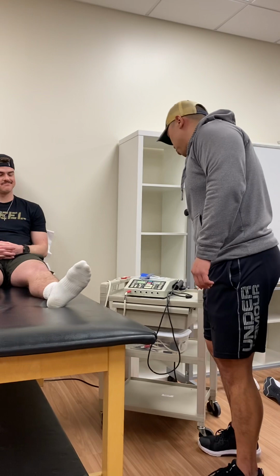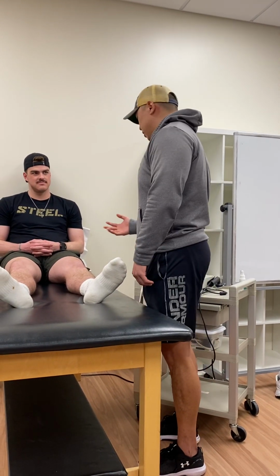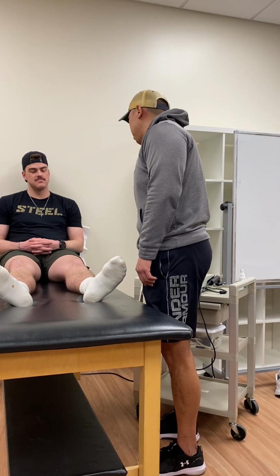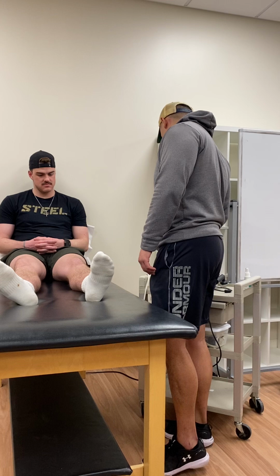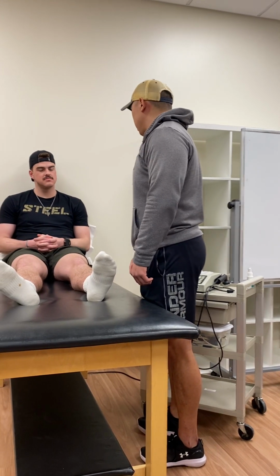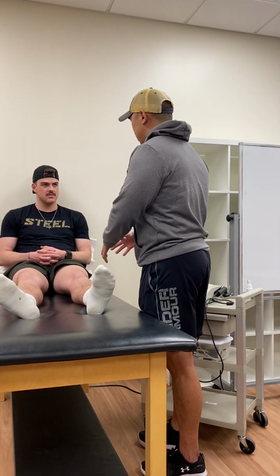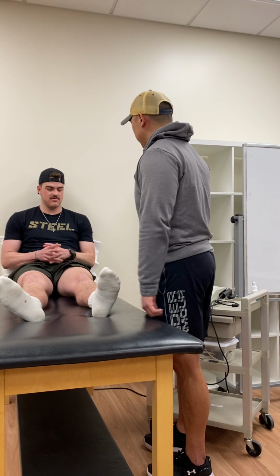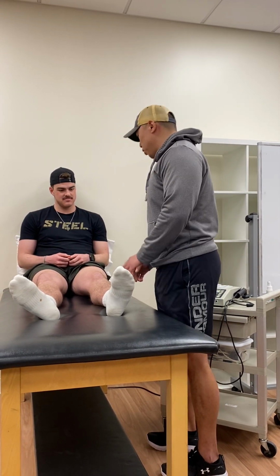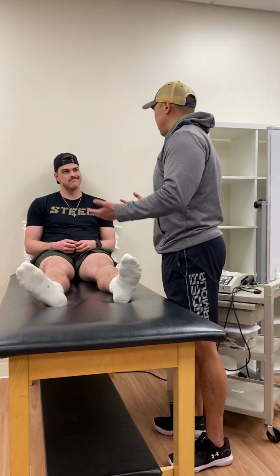All right, how you doing, Brandon? Good. So I heard you recently had a right ACL reconstruction. Yeah. And it looks like during your straight leg raise, you're having a little bit of an extensor lag issue. So today we're going to be doing estim. We're going to be doing biphasic. Have you ever used estim before? Yeah. So you're pretty familiar with how it works, and it's just going to give you a little bit of contraction. It'll be a little tingly.